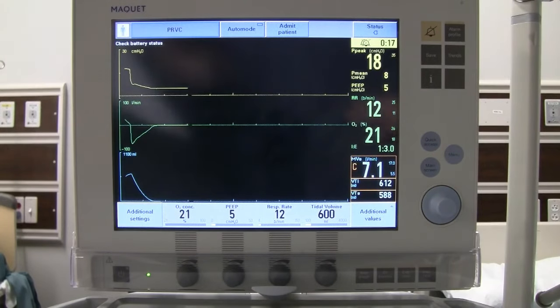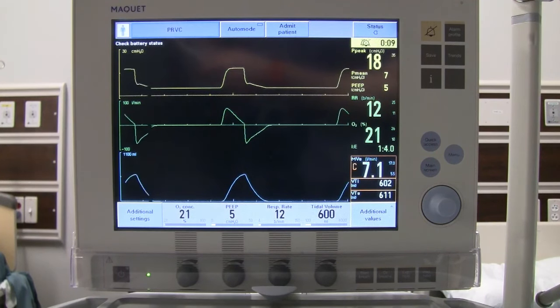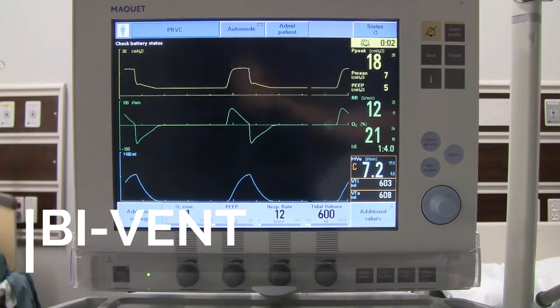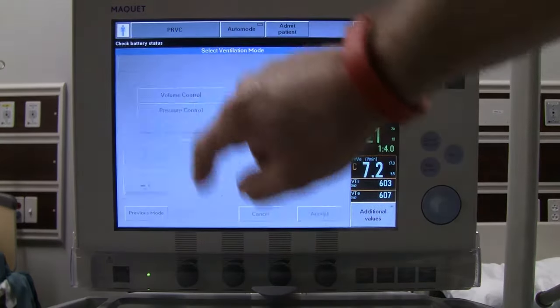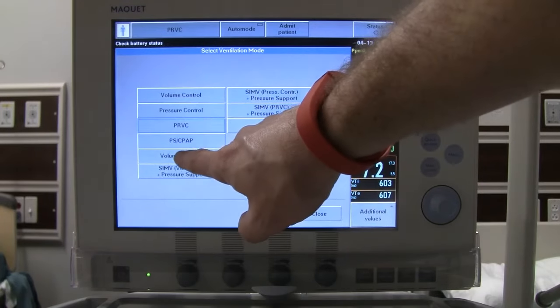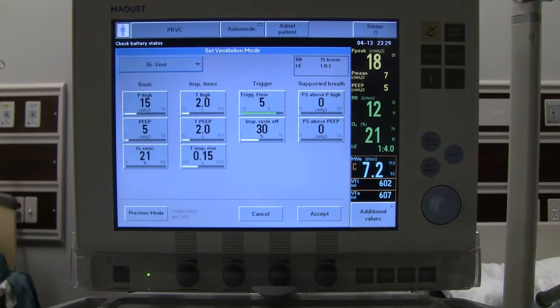With PRVC, it's important to set alarms appropriately — if not, the delivered breath will have problems and adjustments will be needed. PRVC delivers much more like a pressure control breath with a volume guarantee that it's trying to reach.